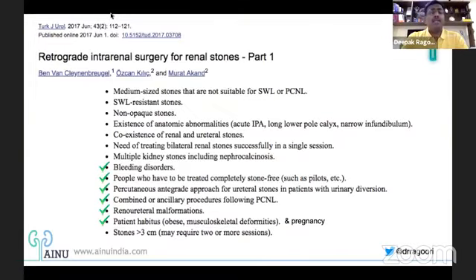Having said the indications and a few contraindications also, there are special situations in flexible ureteroscopy which make our life much easier. And that's the beauty of having a flexible ureteroscope in your hand, like patients with bleeding disorders and patients who might not be symptomatic, but professionally they would want their stones to be cleared. I guess now every one of you might be seeing these pilots and merchant navy guys coming to you for a complete clearance. These are the scenarios where you can use flexible ureteroscopy very well.